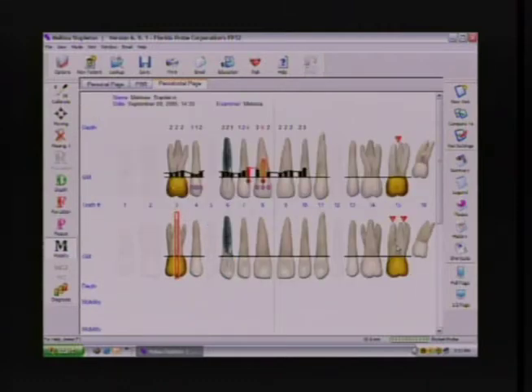Upper arch. Mobility. And it moved into mobility. Quick taps advance and record a 0. So advance to 7. Record a class 2, 1, 2. Class 1, 1. Class, midline. 1. 1. Good. Advance to 15. Confident in the upper arch? Yes. Let's advance to the lower.